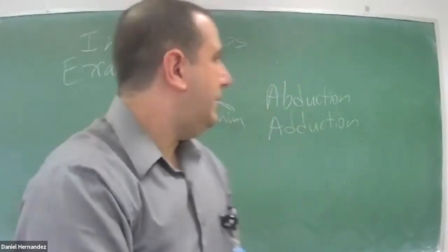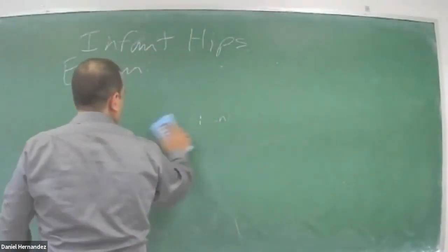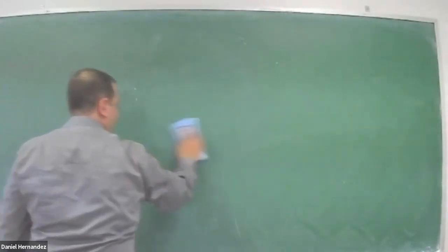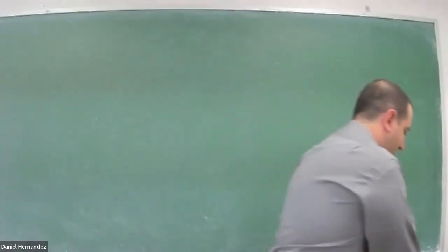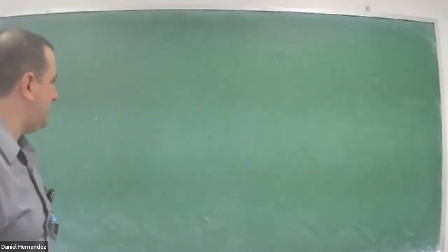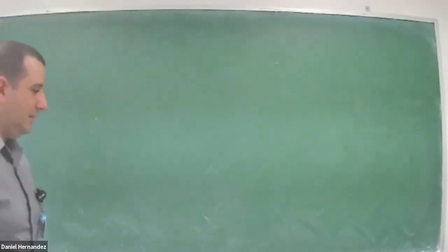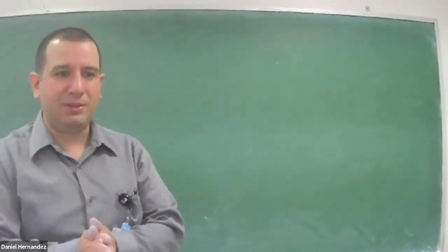So, any questions about these ultrasounds? They're not too bad once you start doing them. You just have to be quick on the freeze and capturing your images. It's a lot of sitting and looping back. You need two hands on the baby, so it can be a little bit tricky. But they're not terrible. It's not a lot of pictures.